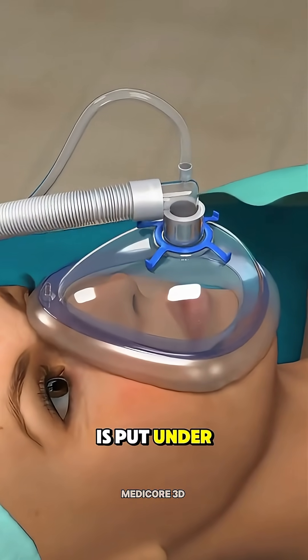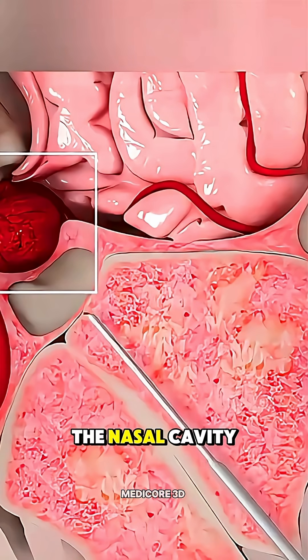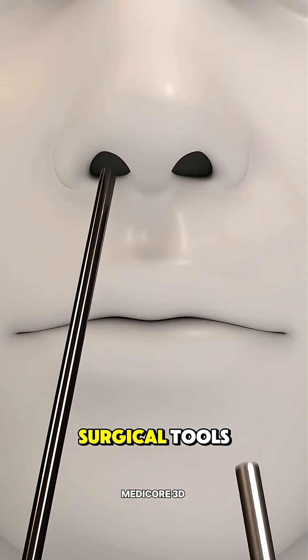First, the patient is put under general anesthesia. The surgeon works through the nose and makes a small opening in the nasal cavity to reach the tumor without opening the skull, using a tiny camera and special surgical tools.